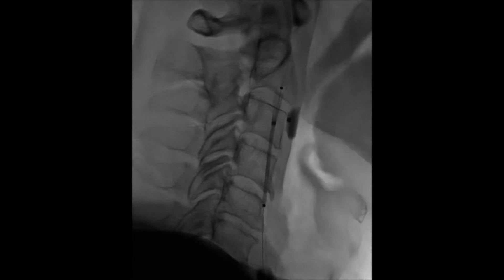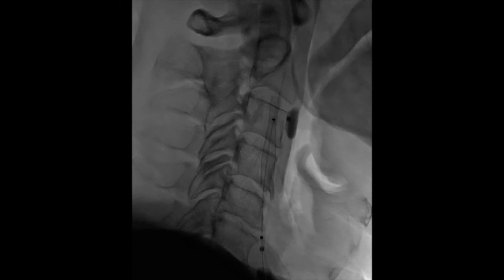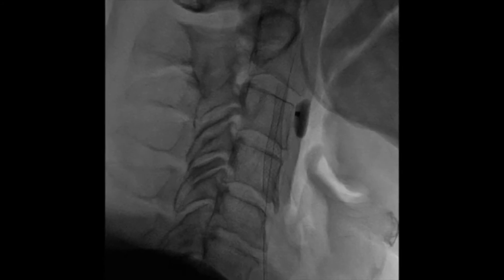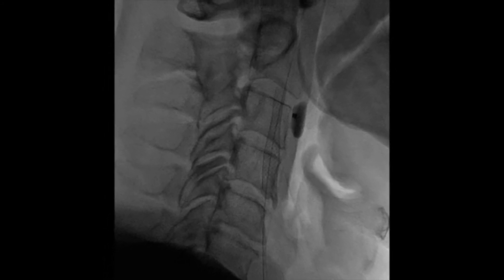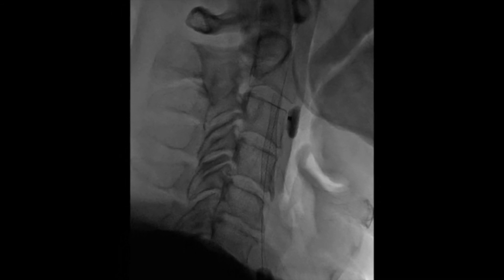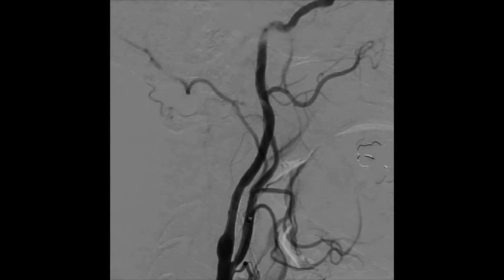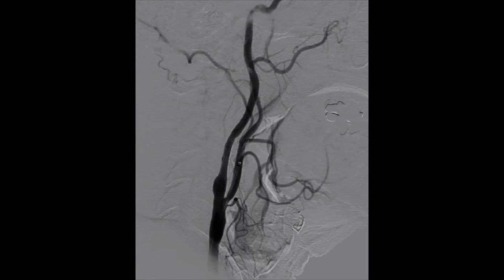A carotid stent is deployed under flow arrest from distal to proximal. After the stent is deployed and while still under flow arrest, through the MoMA catheter we aspirate 10 to 15 cc's of blood and look in it for debris. Once we see no debris, we deflate the balloons with the external first and the common second, to prevent any debris from going intracranial once flow is re-established. Final control angiography demonstrates re-establishment of flow through the stented internal carotid artery.